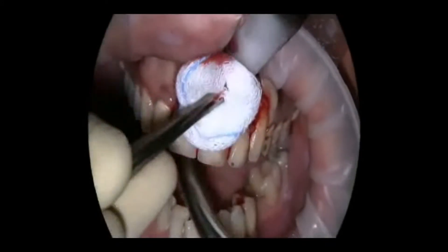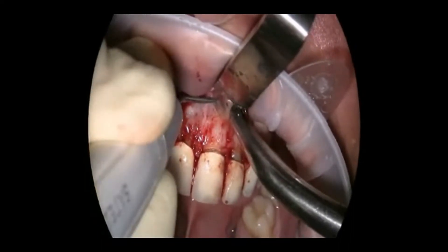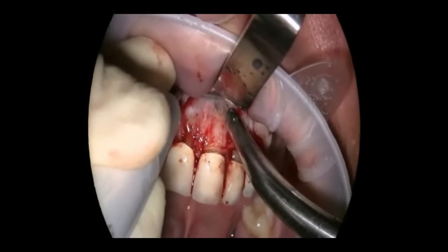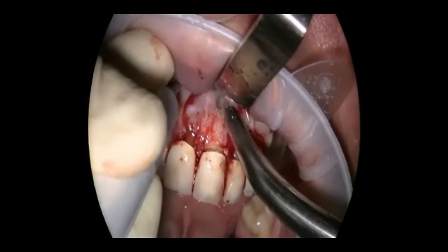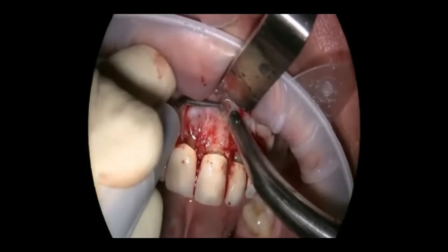Now, the root is conically refurbished from below using special instruments. The pink parts are remnants of the old root canal filling. Root refurbishment is done with ultrasound instruments and water is used for cooling. As soon as a nice opening has been prepared, renewed measures are taken to stop bleeding and clean the area with alcohol.